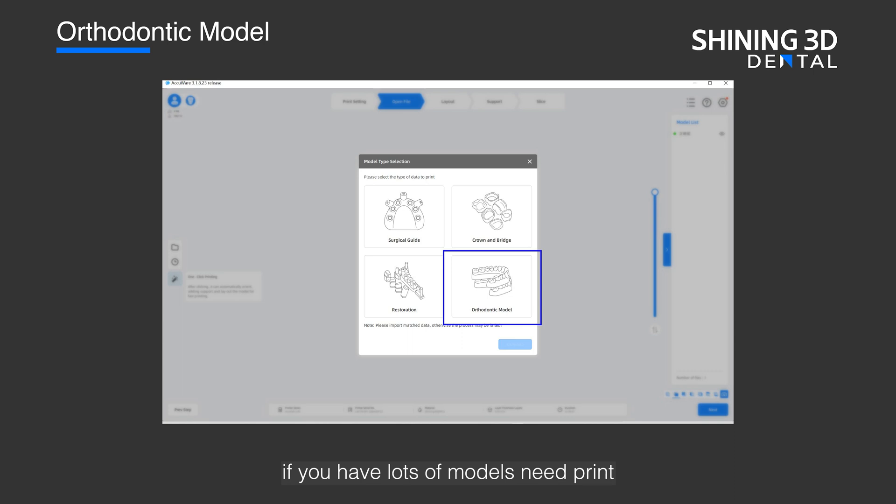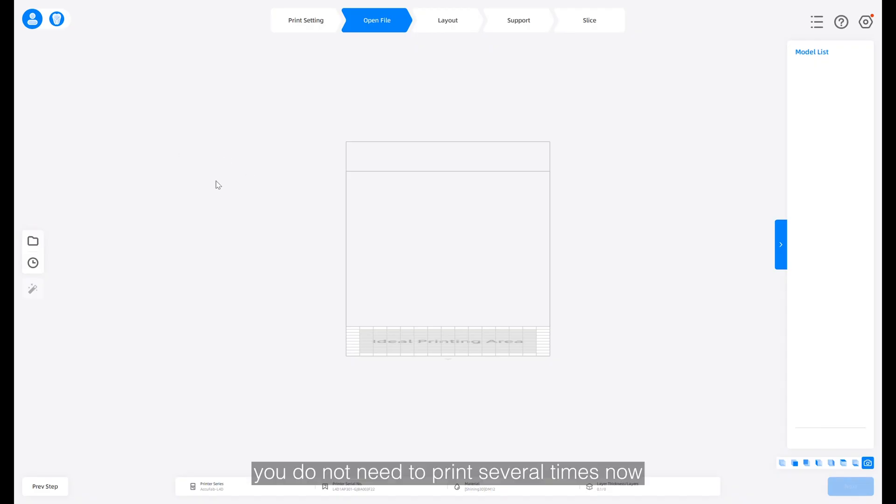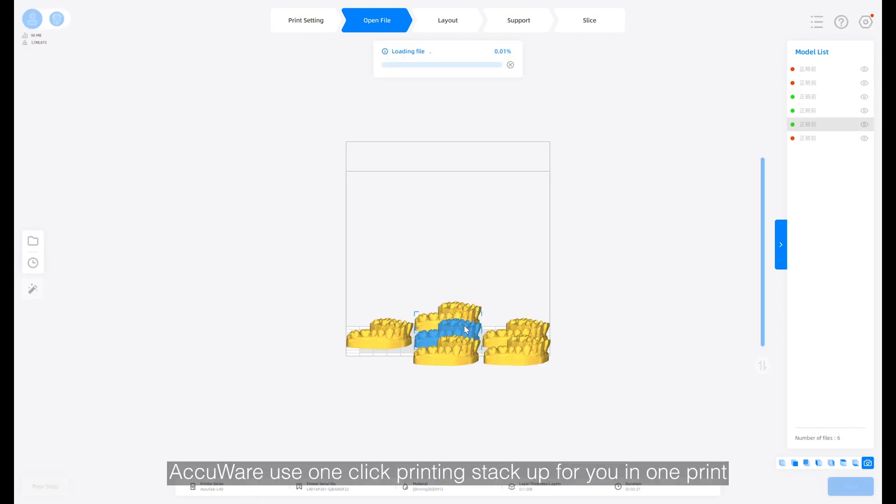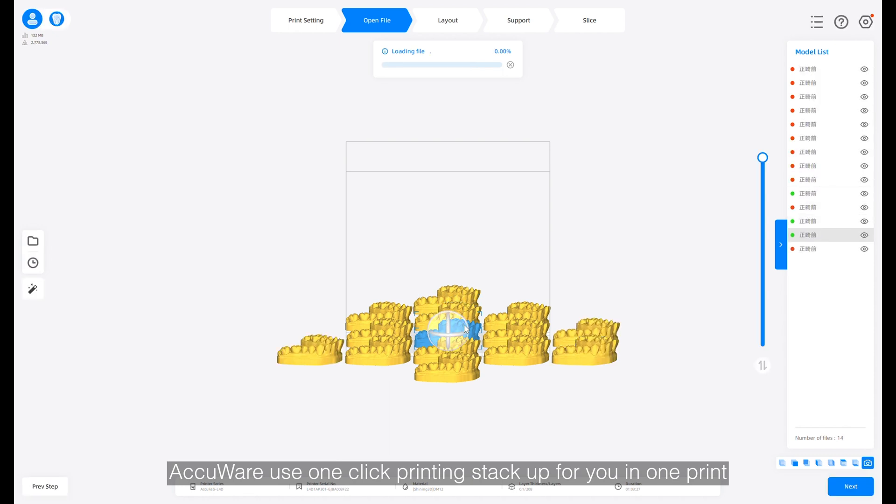For orthodontic models, if you have lots of models that need to be printed, you do not need to print several times now. Instead, AccuWare will use one-click printing to stack them up for you in one print.